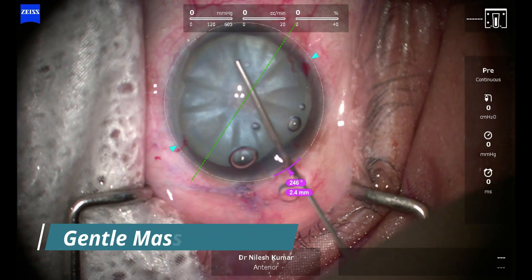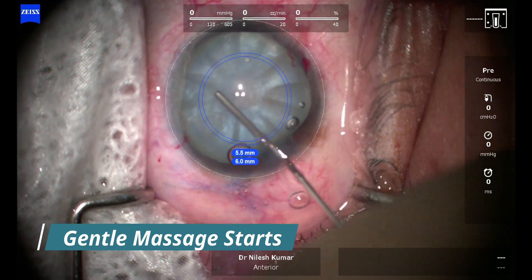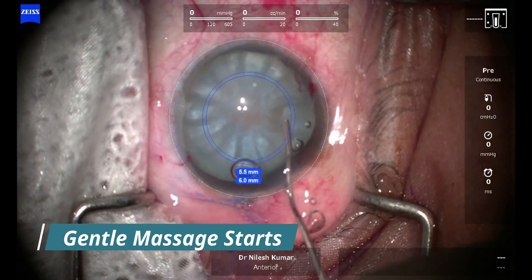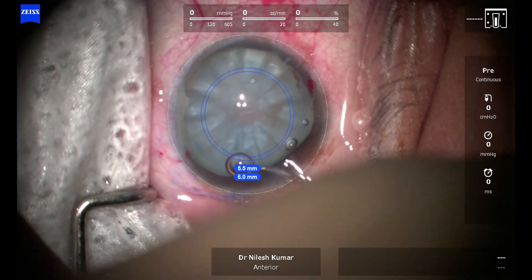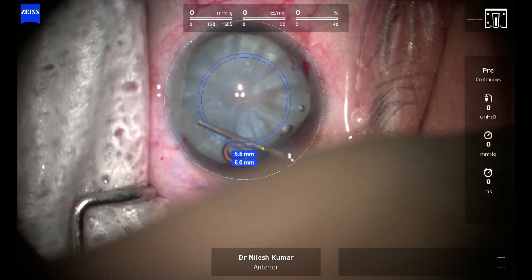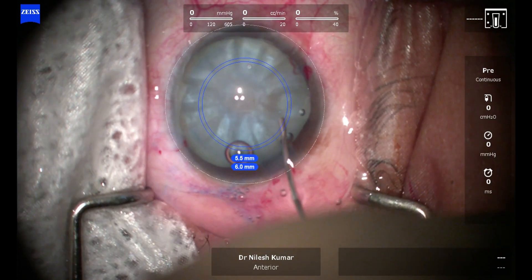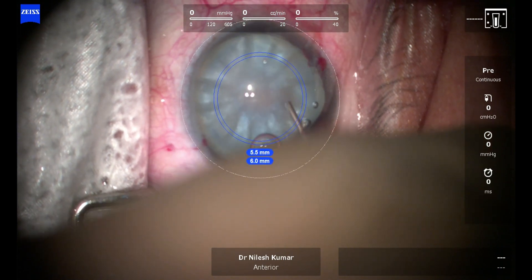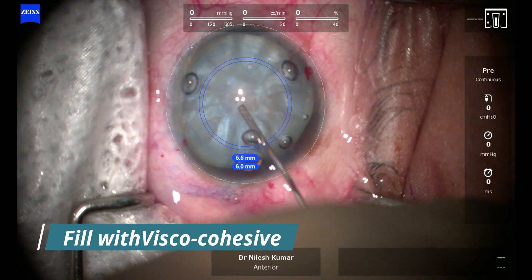What I am doing is gently massaging after making a soft shell, and with the same viscocannula I am just gently massaging. The aim is to break all the fluid pockets so that each of the fluid pockets communicates with each other and through a central core. The aim after that will be to create a central puncture from where all the fluid will ooze out.